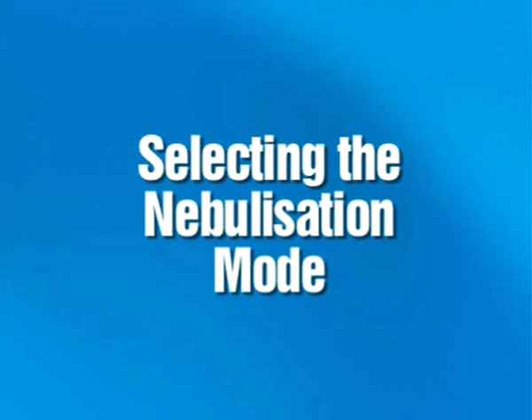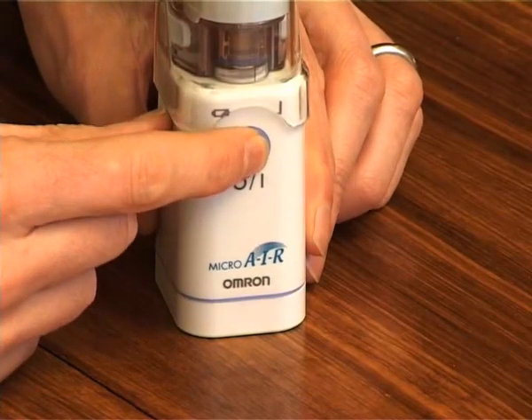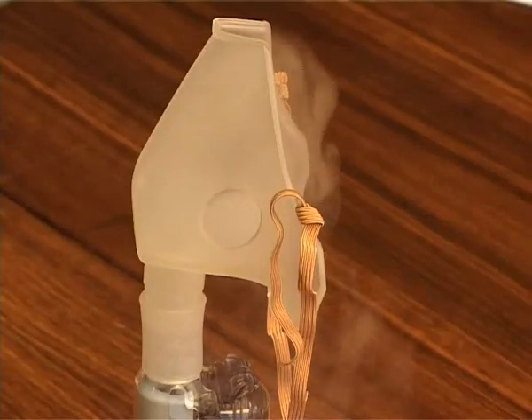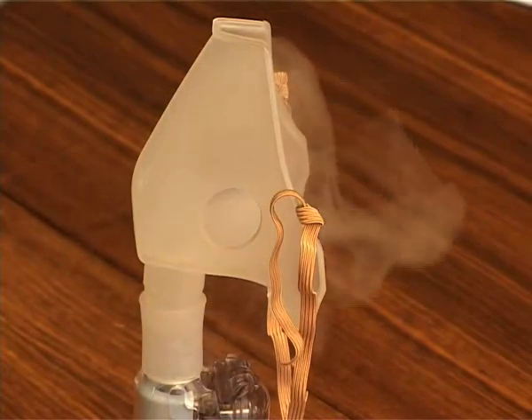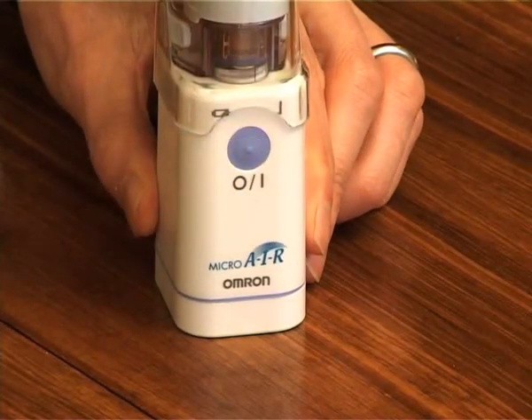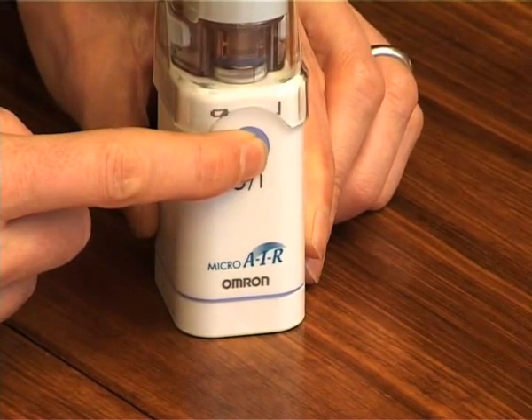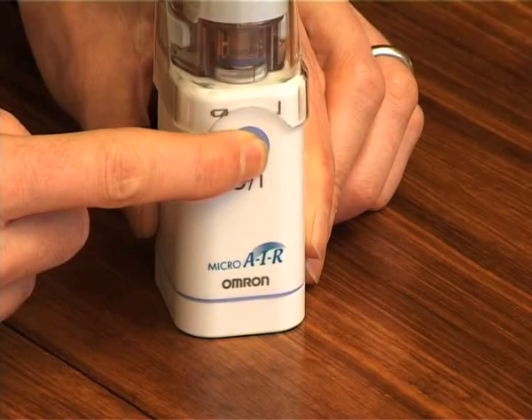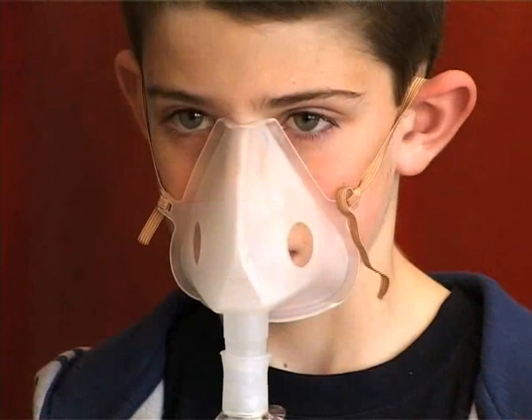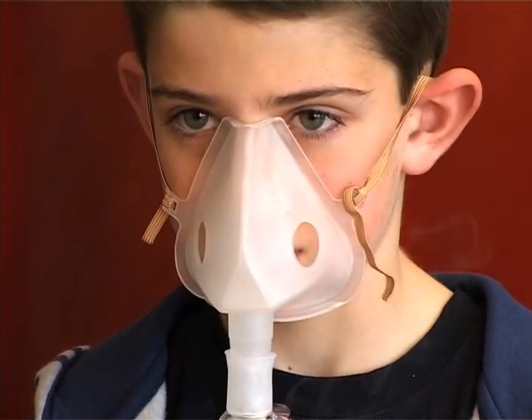Selecting the nebulisation mode. If you push the on button and immediately lift your finger away, the unit nebulises in continuous mode. If you push the button again, the nebulisation stops. If you keep pressing the button for more than two seconds, the unit nebulises in manual nebulisation mode. By using this method, you can inhale in tandem with your breathing.